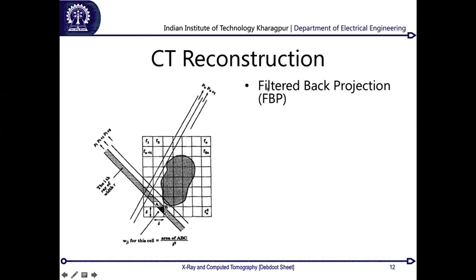So what it does is, at one particular projection you backtrack this whole thing, so you basically get down the inverse of the Fourier transform of this one. Now what you have to do is smear it back into this length of the line, and then you take all of the multiple projections and keep on subsequently smearing them back, and together at the end of reconstructing using all of these projections you will get your whole image, which would look something similar to the actual attenuation map which was supposed to be there at every different place.